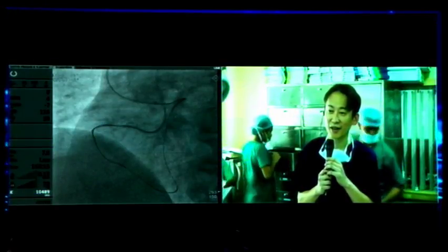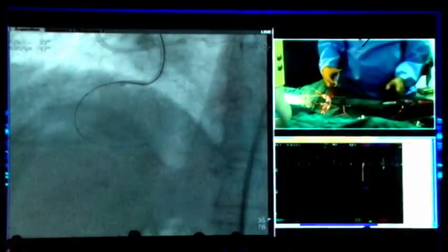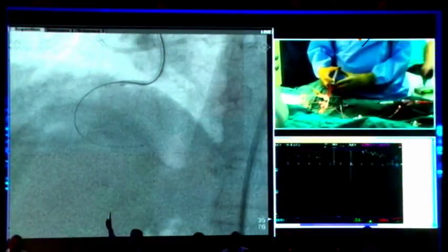Okay, good. Arun, just hold on for a second because Tell Dr. Nasu that we are going to come to him in 5 minutes. Ask him to wait. Just tell him to wait for 2 minutes minimum. We are seeing an important step of bossing. So, Dr. Nasu, we are coming back to you in 5 minutes. Give us 5 minutes. Back to Arun, back to Arun. Vipin, can you go to Arun? Vipin, please don't switch the cath labs without asking us.